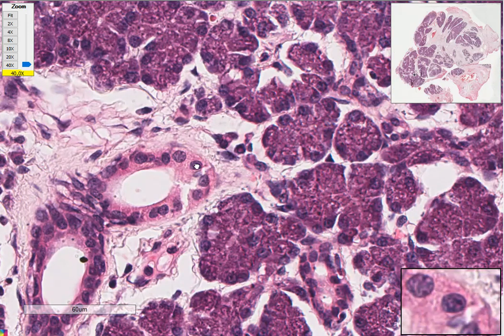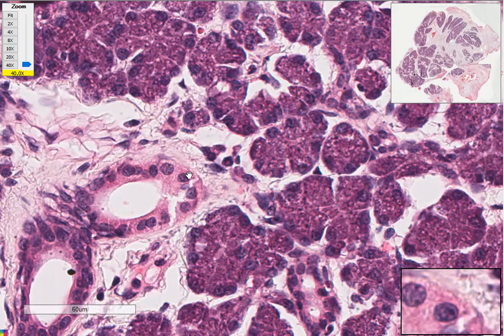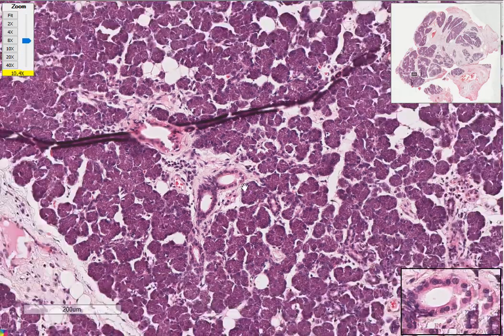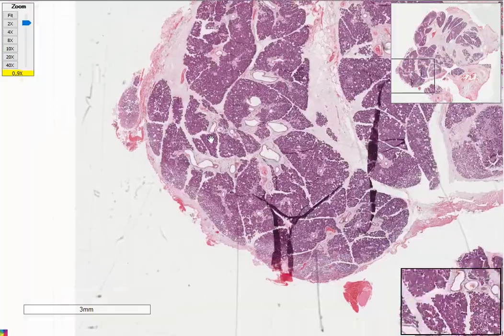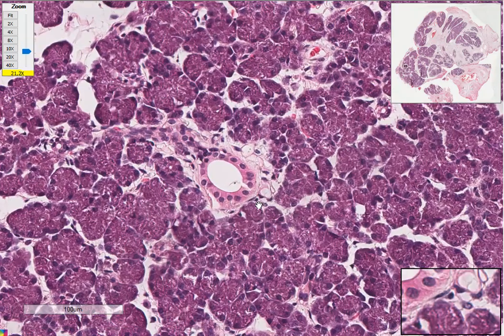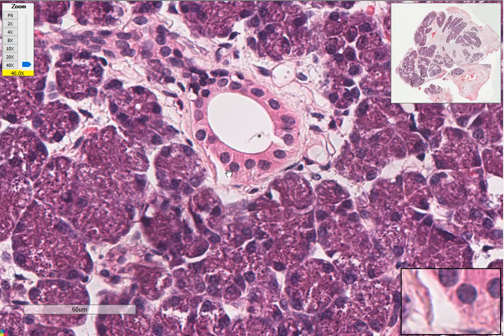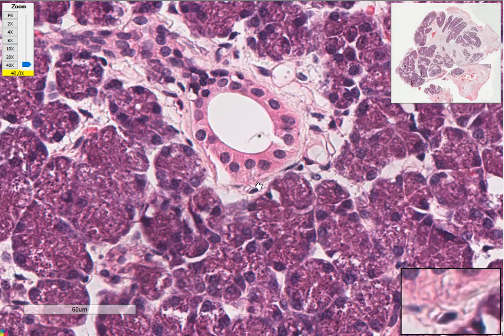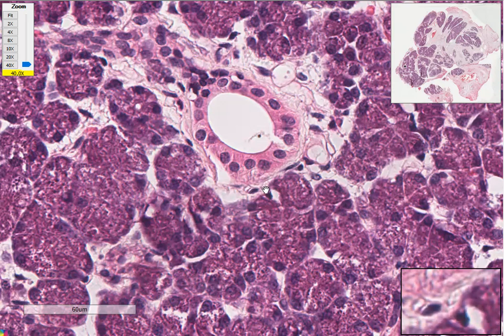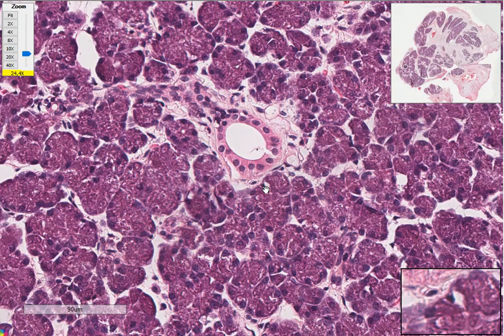it may not be fully appreciated on H&E, but you can see it forms these basal membrane foldings. Let me look for another striated duct and show you. Yeah, I think this could be a nice striated duct. It has these basal membrane enfoldings, but on a better resolution microscope or electron microscopy, you could see these things.